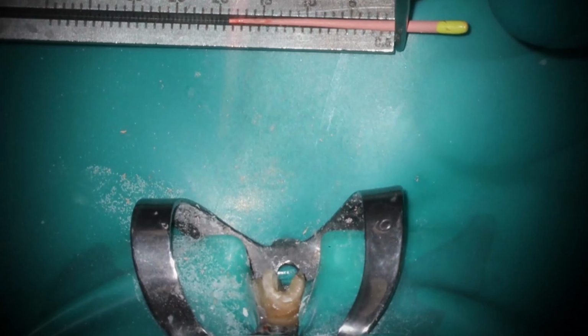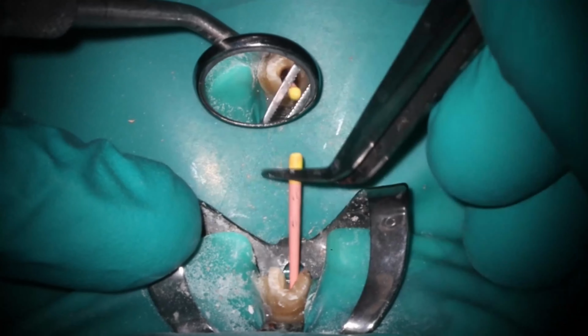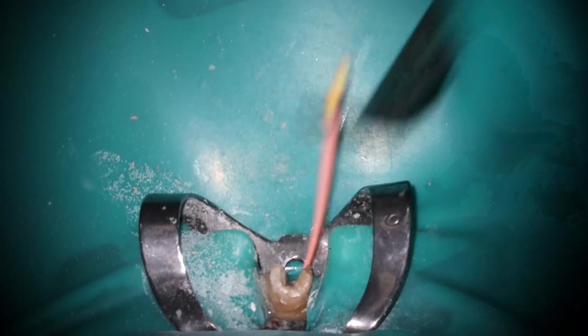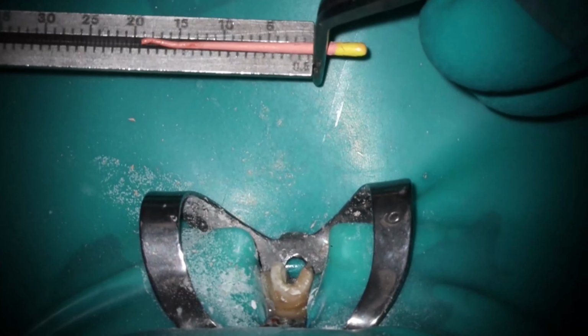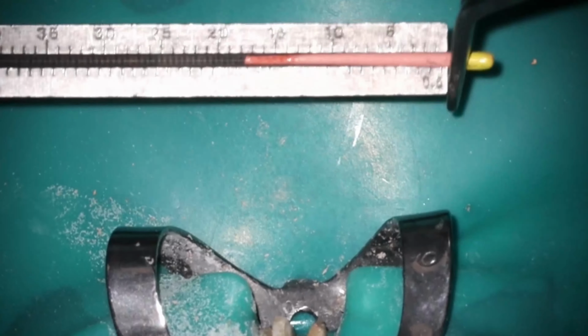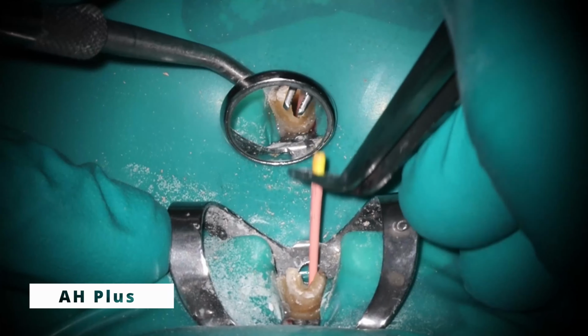When you're doing large sizes like this, you need to keep measuring and keep pushing. You'll see I'm putting a fair amount of force apically on this because when you obturate, you're going to put that same amount of force. You can see all of these are showing long on there. That's still at 19, still pushing down, still dropping down. If you use the yellow, you can actually see where it is. At that point though, we were solid at 18, even with the pressure.